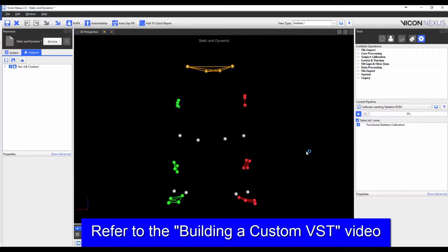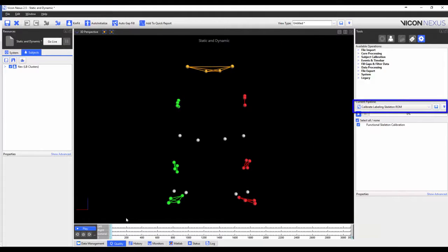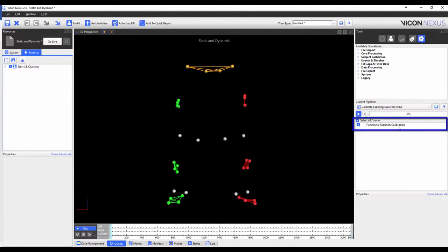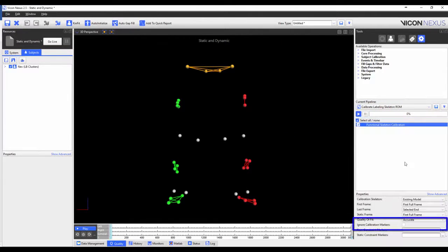I'm now going to go through the trial and make sure that my markers are properly labeled — that is, if markers switch, I switch them back; if markers become unlabeled, I label them properly. However, I do not gap fill. This is the exact same procedure that we used in the building a custom VST video. Once this is done, I'm going to make sure that the Calibrate Labeling Skeleton ROM pipeline operation is loaded, and I'm going to highlight Functional Skeleton Calibration, and then I'm going to check Ignore Calibration Markers. This is because the knee and ankle joint calibration-only markers have been removed from the VSK. Once this is done, I can press play.